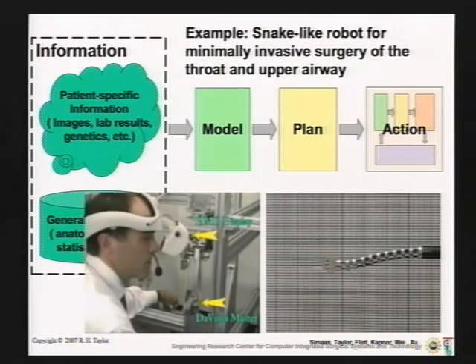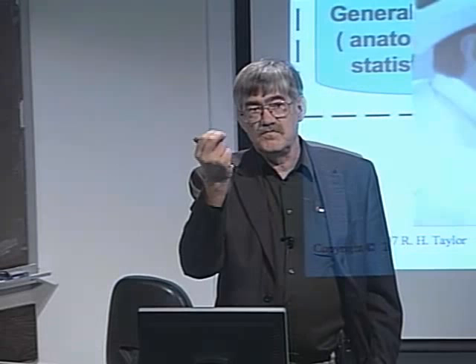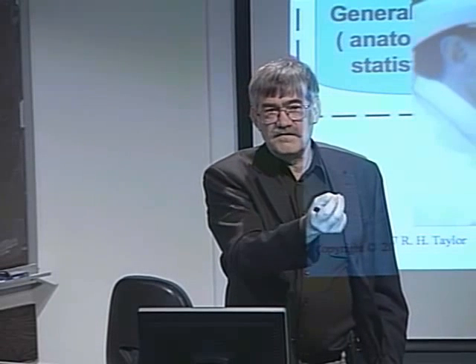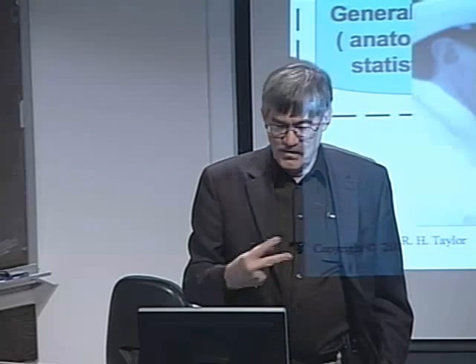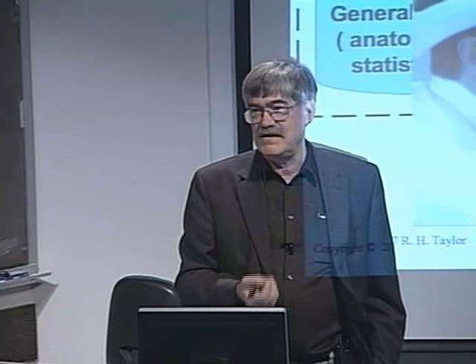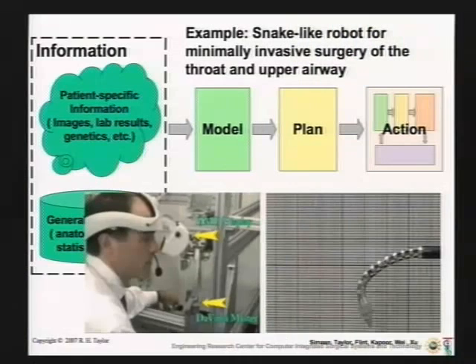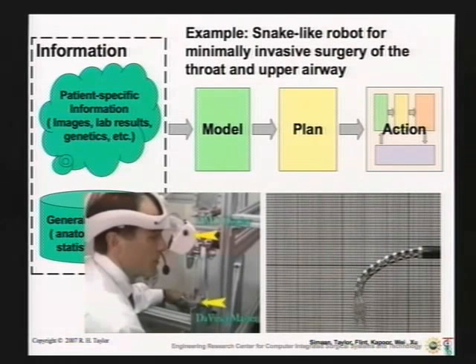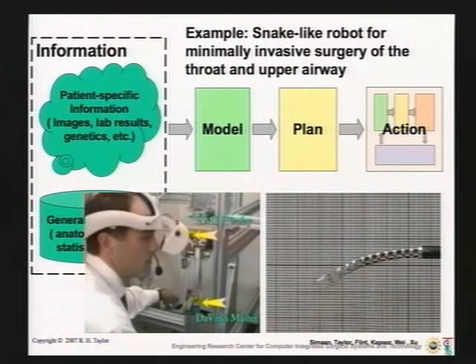Now here, what we have is looking onto robots. One of the problems with, or good things about, the Da Vinci is it's marvelous. As you make the instrument smaller and smaller and smaller, eventually you get to a point where all those little bearings and pulleys and pivots would not be economically manufacturable. So here what we've done is we built a snake-like robot with only bending metal. What we have down the outside of the robot is 3 spines.